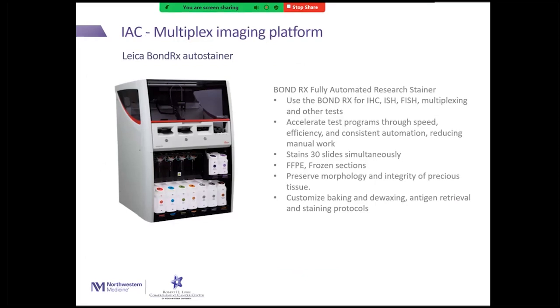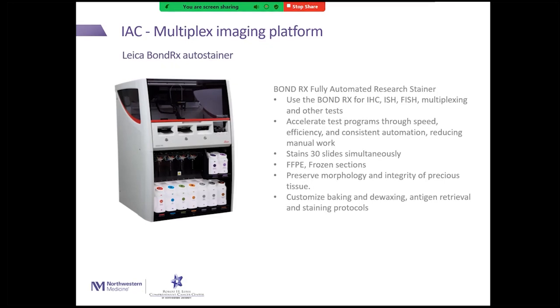So starting with the technologies that we have in the core. First, we have the multiplex imaging platform that consists of a Leica Bond RX autostainer. Our autostainer is a fully automated research stainer where you could run 30 slides for staining simultaneously.